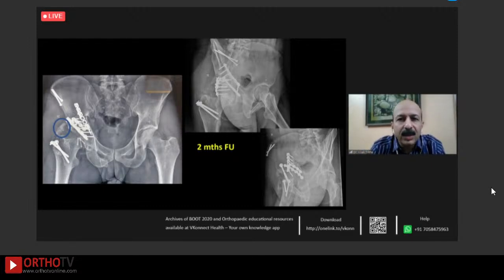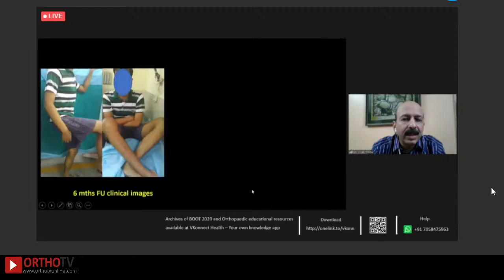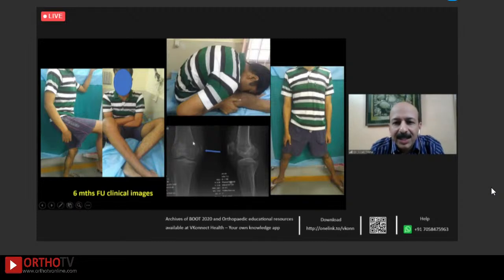But as you would see here, if you see a lateral view, the reduction of the posterior side is okay, but anteriorly you are having that heterotopic ossification. This was his 6 months follow-up and he had some knee issues as well, as you could see. There was a calcification at the medial condyle, Pellegrini-Stieda sort of a thing, which was limiting his knee movements, but you could see that he was able to flex his hip and abduct the hip to a great extent.